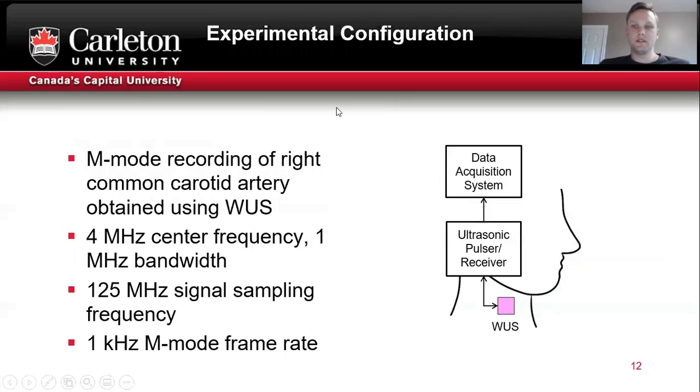The experimental configuration is shown on the right. An M-mode recording of the right common carotid artery was obtained using the wearable sensor. The wearable sensor has a 4 MHz center frequency and 1 MHz bandwidth, sampled at 125 MHz with a 1 kHz M-mode frame rate.